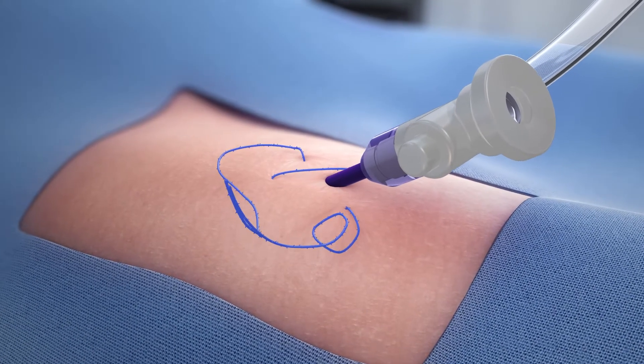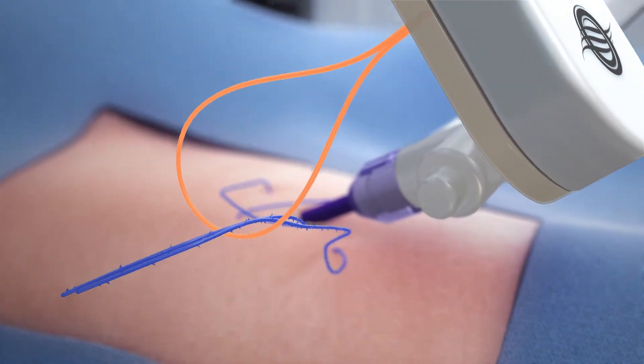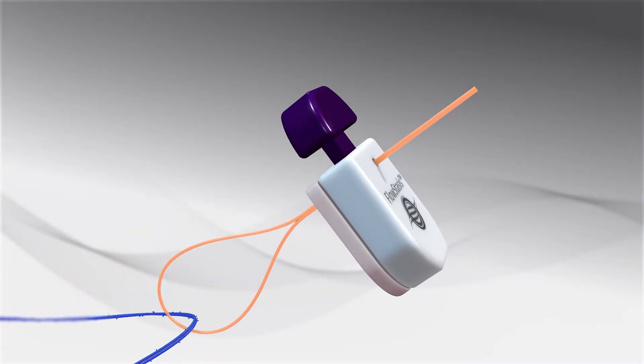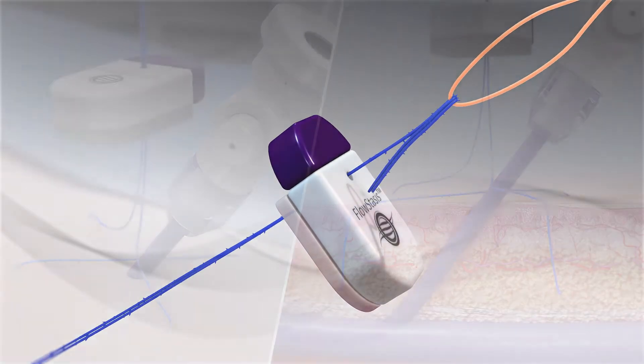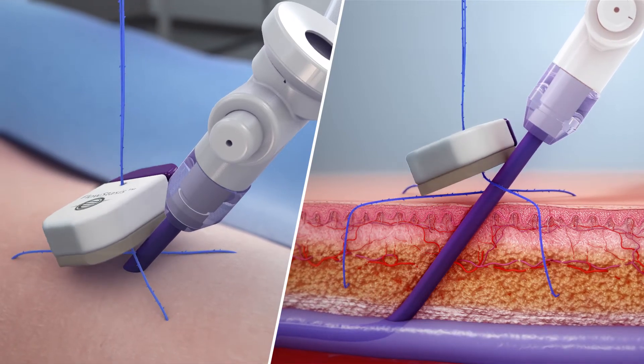Following a simple figure of eight or purse string stitch, the suture ends are threaded through the loop on the preloaded threader. The purple tab is then actuated to open the cinching components. The threader along with the sutures are pulled through the device, and Flowstasis is advanced towards the access site.